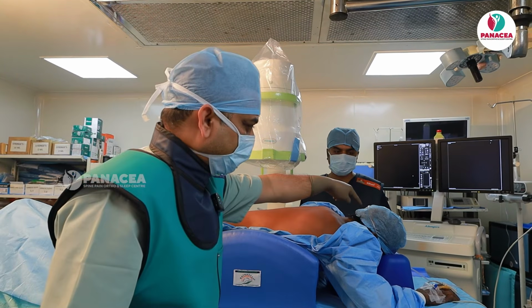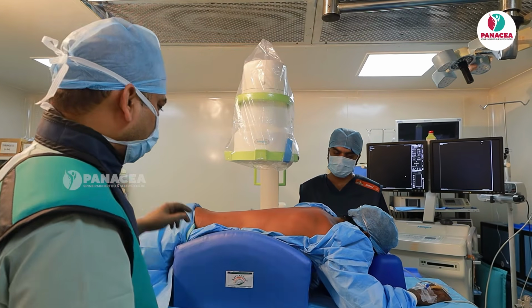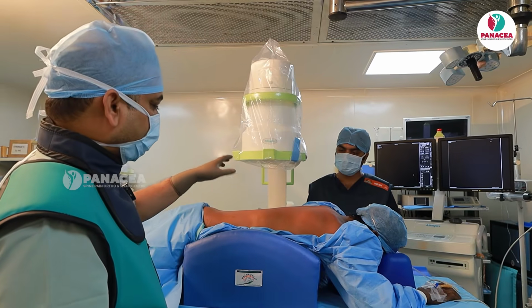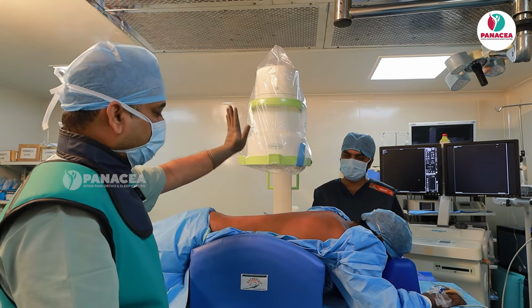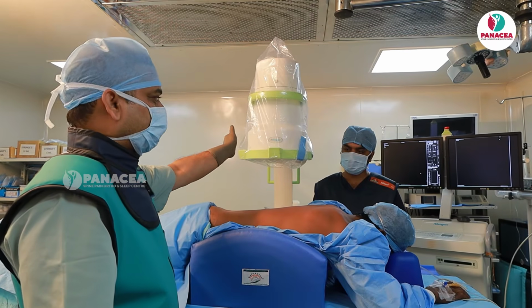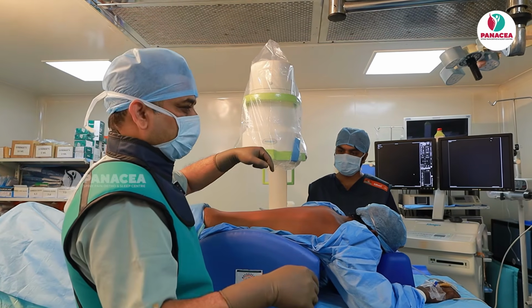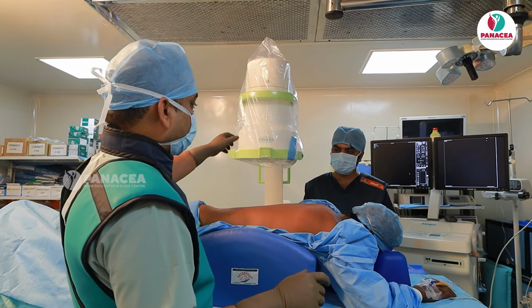You see here, oxygen is connected. The patient, yeah, he is speaking to me. So that particular area where you are going to do the procedure, you scrub and drape. And if you see here, in this case, the patient's right hand is this side, left is the other side. So the C-arm should be placed exactly on the side where we are doing the epidural injection. That is mandatory. Ergonomically, you should stand exactly opposite to the fluoro, and since we are doing a coaxial view or end-on view or tunnel view, the C-arm is your eye.